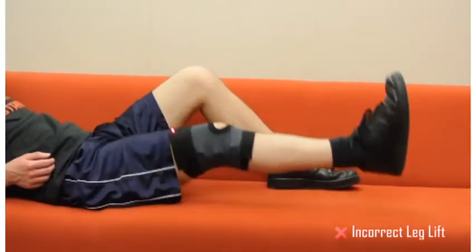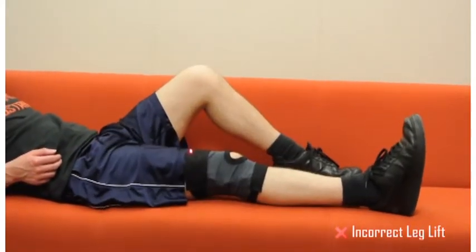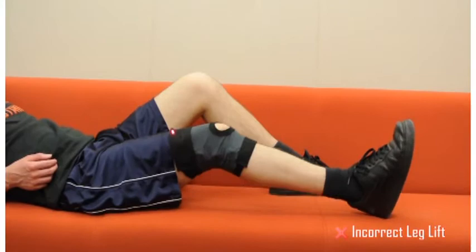The knee brace can classify two different gestures based on the type and quality of motion of the patient's knee. The first gesture the Knee can recognize is the leg lift, which can be done incorrectly if the patient does not keep their leg straight or if they raise their leg too high.